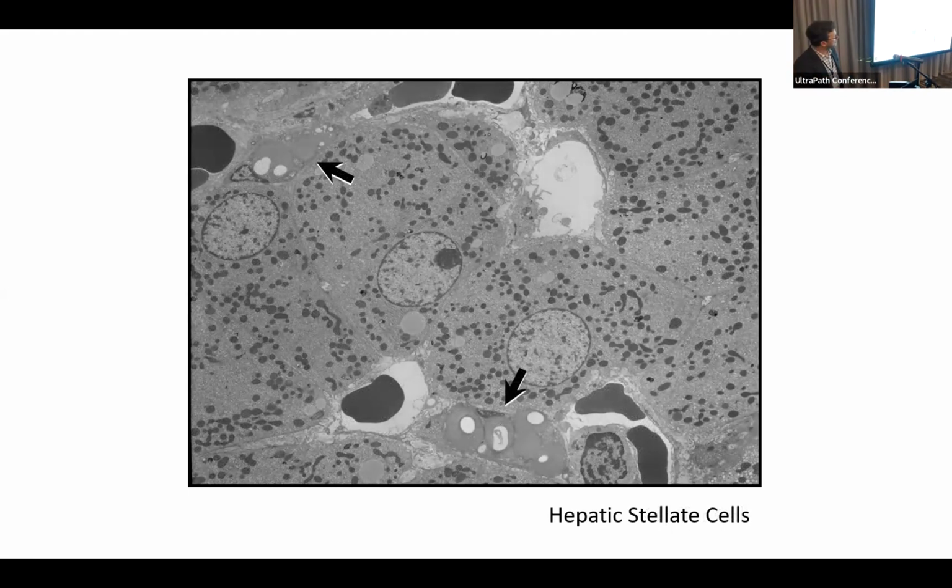As for some of the other cell types, there's really not a whole lot of them. I think liver is kind of accessible because there are not a lot of different cell types that you need to know. But another one is the hepatic stellate cells, also called Ito cells or fat-storing cells. They're wedged in the space of Disse, although usually when we're screening these, you can't always tell. So this would be the hepatic stellate cell down here.